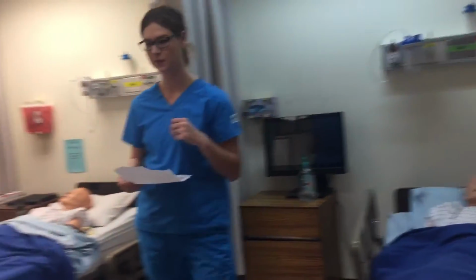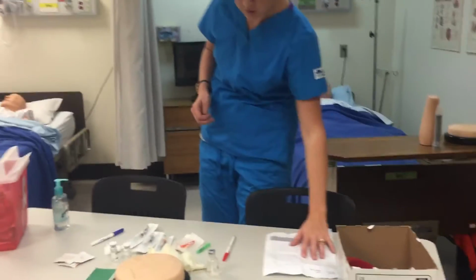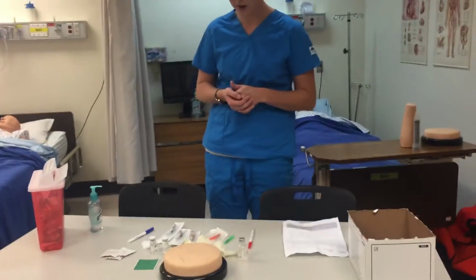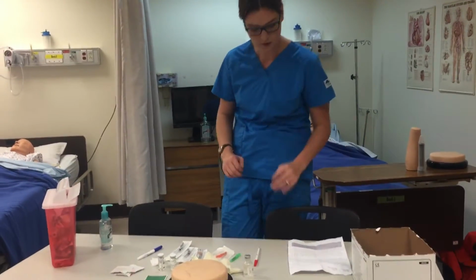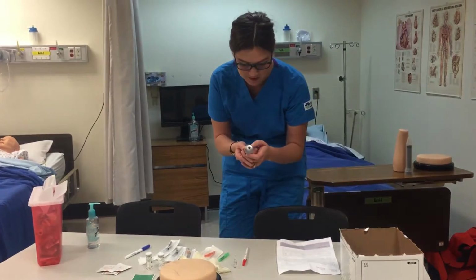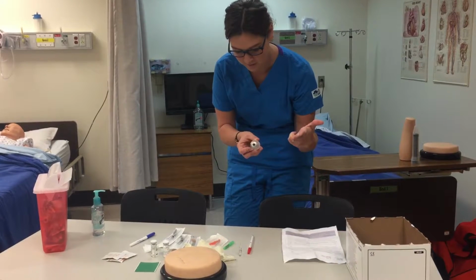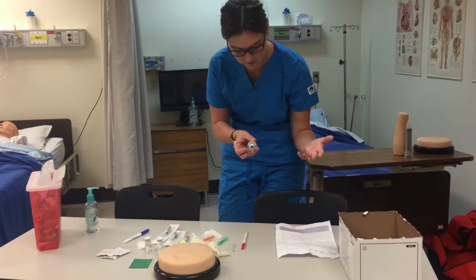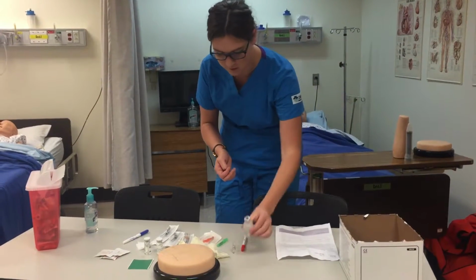So I'm going to leave. Make sure the bed rails are up, patient's down, patient's comfortable. Okay, so when I prepare my injections, I'm going to look at my MAR, and I'm going to make sure that my MAR matches up with all of the medication I've pulled. So I'm going to look at my tuberculosis test first. That matches my MAR, that matches my patient, medicine, time, route. I'll do the proper documentation, and dose. Okay, so I'll check the dose when I pull it.